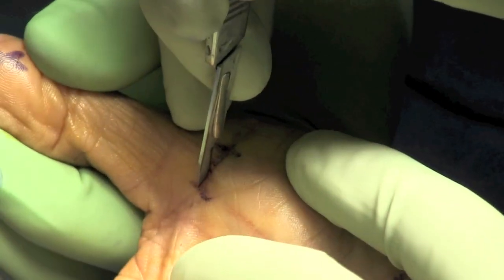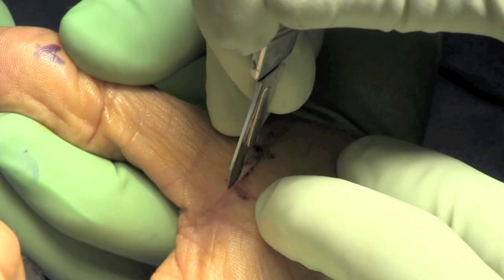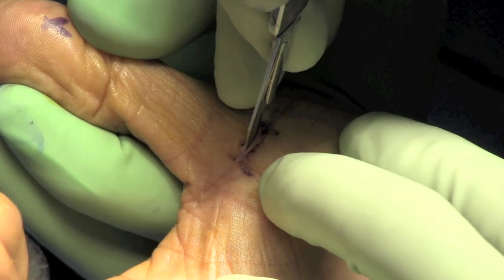Care is taken with our incision to ensure that we only go just deep enough to get to the subcutaneous tissue. This is to ensure that we do not injure the radial neurovascular bundle.